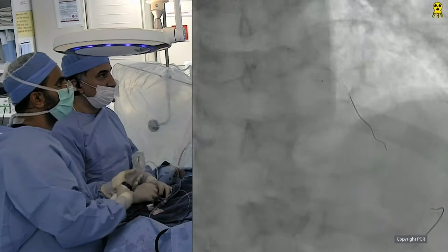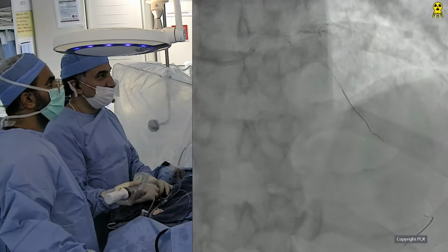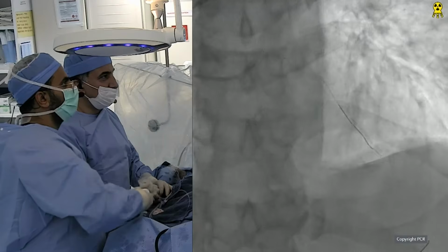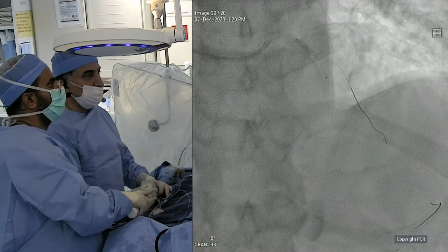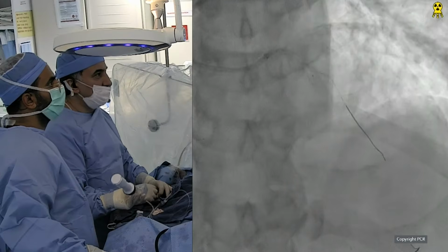But maybe after opening that proximal LAD and now more flow is distally after nitro, it's a bigger artery. I will do DEB if OCT is allowing it. Okay. So the argument would be it's too small to warrant a stent, but maybe a drug-eluting balloon, just to preserve the flow.